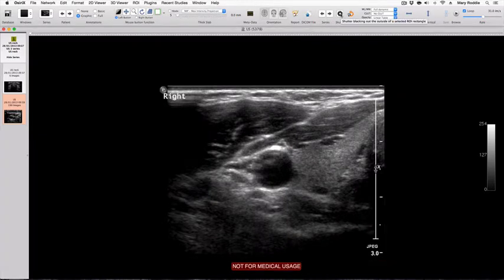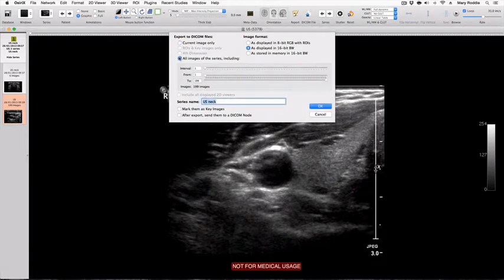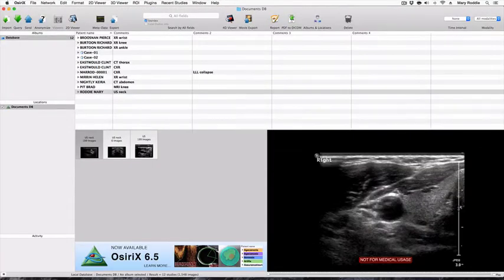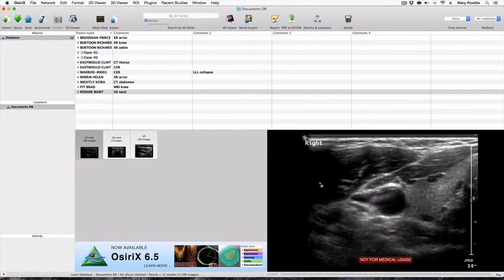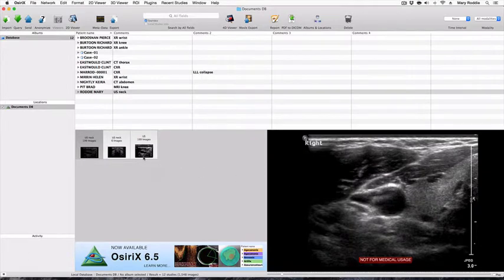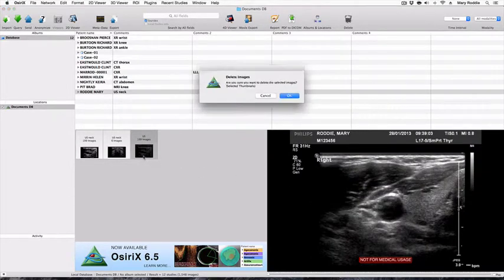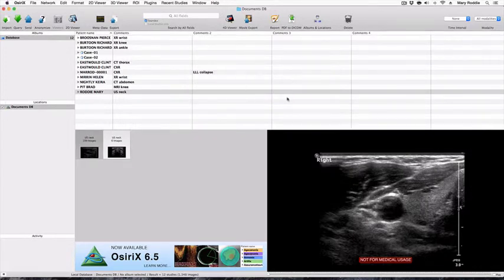Press the shutter tool and then export as a new DICOM series, remembering to press all images of series. I now have a new series of 199 images with no patient identifiers and at this point can backspace and delete the original series.